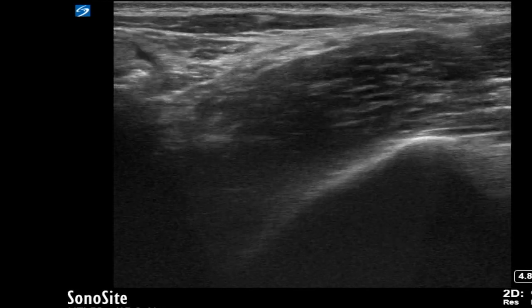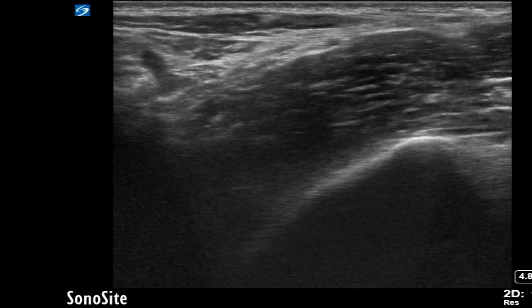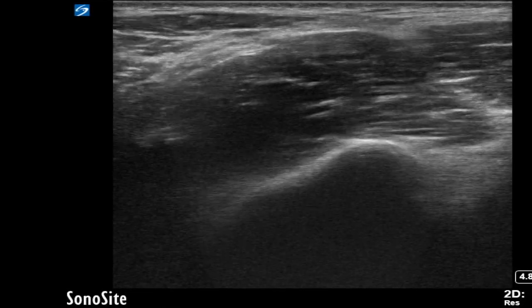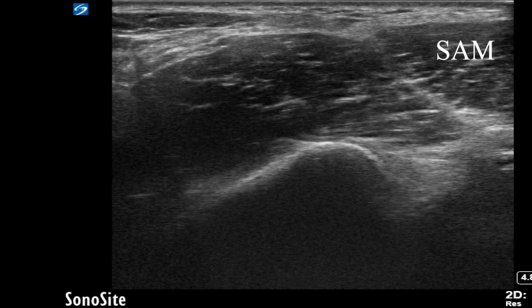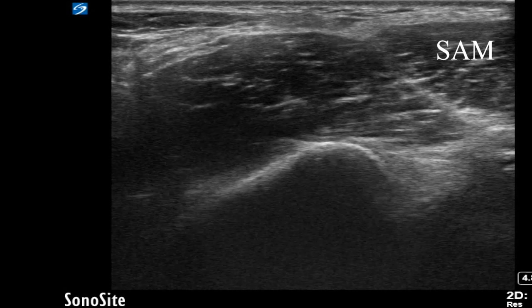If we are in the correct position, moving the probe inferiorly, we should be able to see the sartorius muscle start to come into view.